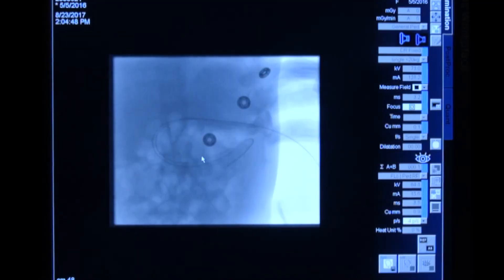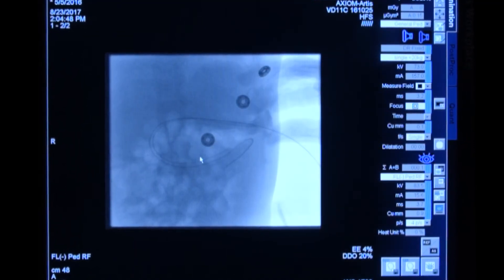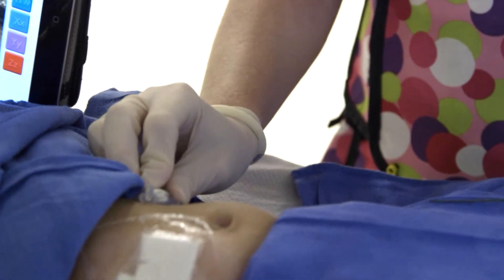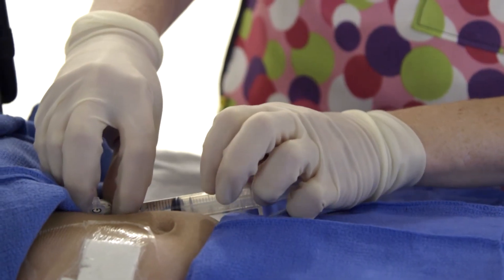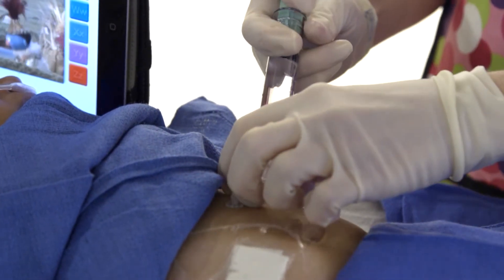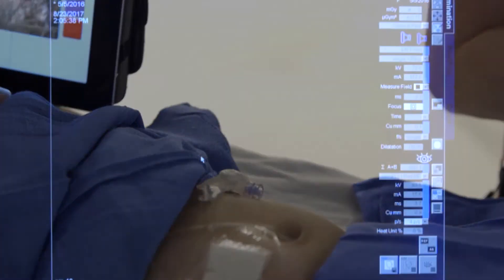Once the tube's almost in, I will step on X-ray again to make sure it didn't move, kink, or change position before I put in that last few centimeters. Then I'll inflate the balloon.